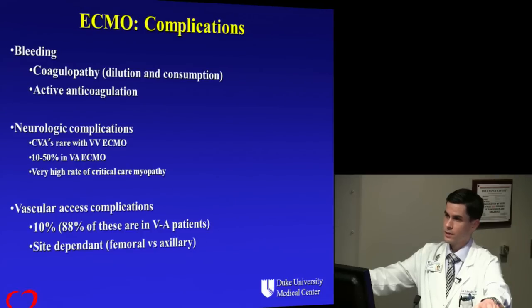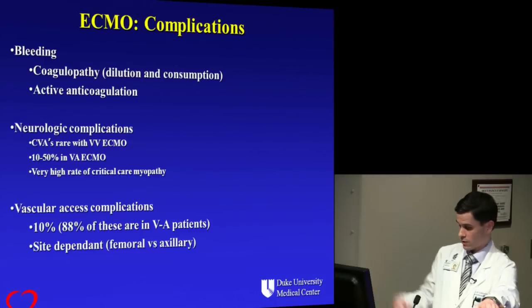And she had some bleeding, but it really wasn't that bad. But what she did have was that the tube graft that we'd sewn onto the axillary artery was compressing her axillary vein too. So she had arm swelling, then she had some bleeding. We had a patient recently on VA ECMO who had a brachial plexus injury, probably from hematoma from bleeding. And then, obviously, it's site dependent. The first patient had a wound infection from his groin re-exploration when he was decannulated.